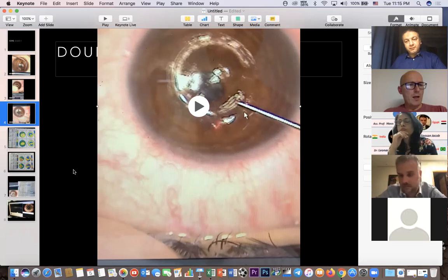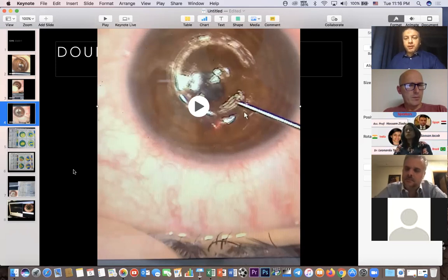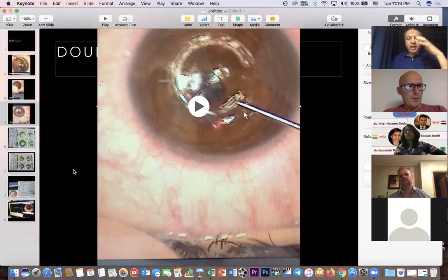Hossam, are you asking about the nomogram, or could you repeat again? The nomogram, when you find the cone, the optical zone of the cone, in the center, in the inferior part, what do you use? Just one segment? One small segment or two segments or one large segment? What do you prefer? I'm asking about the clinical experience, not the nomogram itself, because I have a problem sometimes with the nomogram.